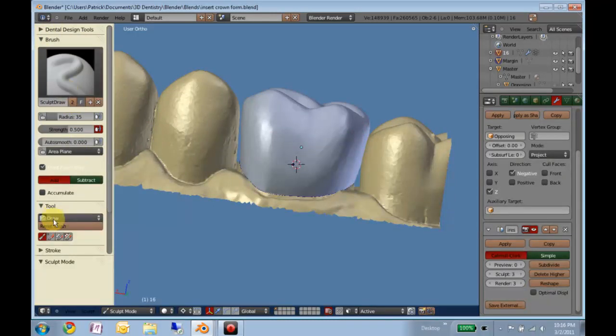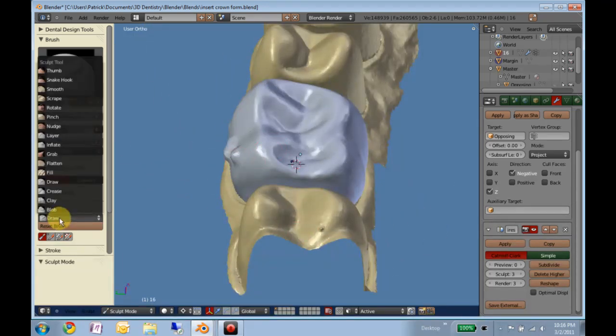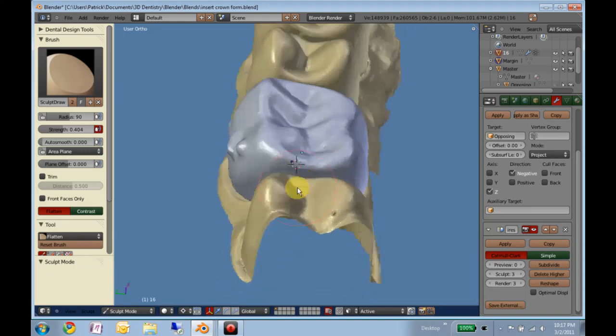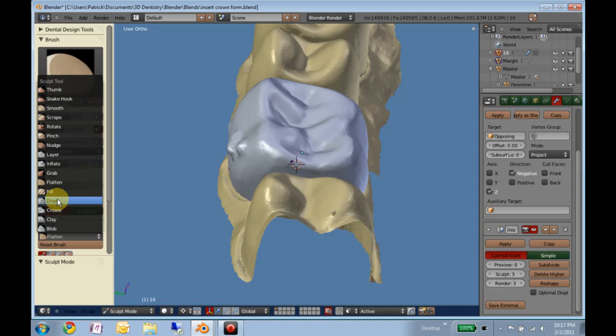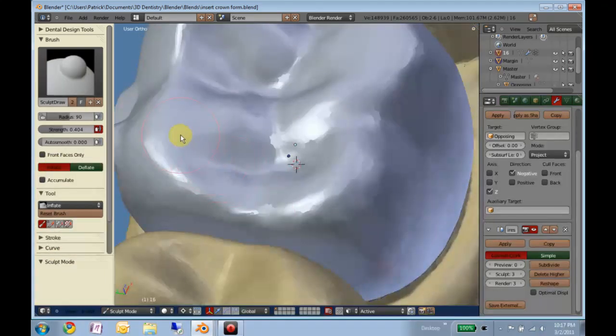The draw brush just adds, so you could accentuate ridges and grooves. One of my favorites is flatten. Say this were an older patient, you could add a wear facet here and there, or if it's a young patient, you can inflate ridges and stuff like that.